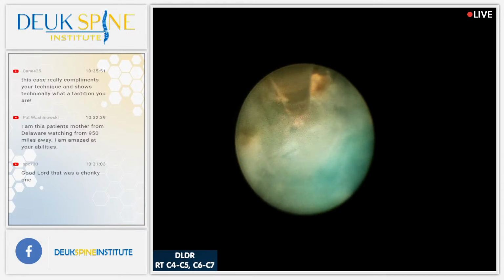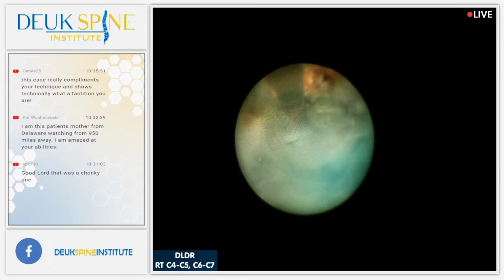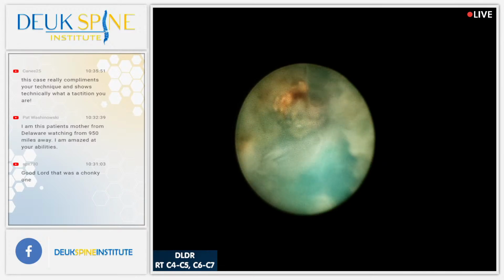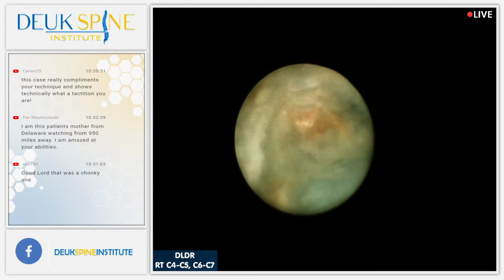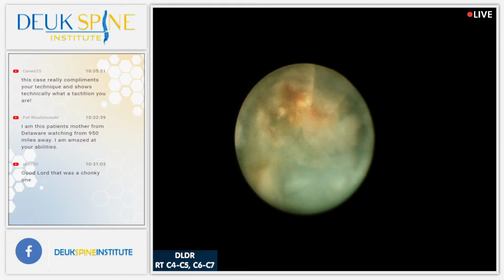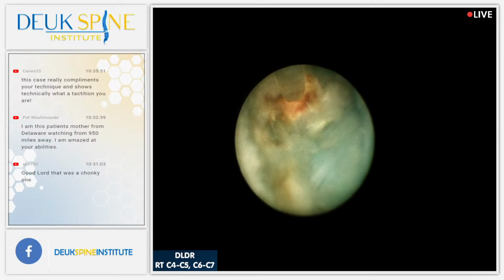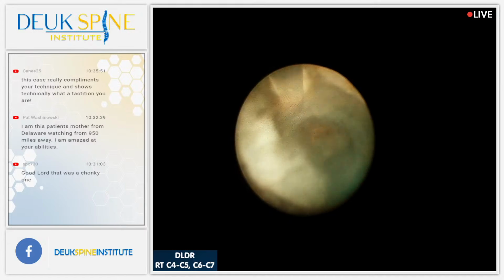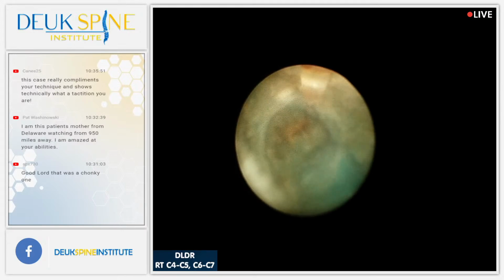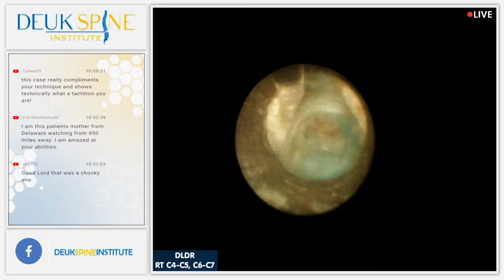Now this herniation is in the foramen. You guys can see the spinal cord. The spinal cord is right here, okay? And it wraps around and it becomes the nerve root which runs out the foramen. And all this stuff is pushing on his nerve. And so I've got to get rid of this herniation in the neural foramen. That's where we are, the neural foramen. Look at that, that wants to come out. Okay? Very delicate work. Remember, that laser fiber is half of a millimeter wide. So you know how precise this really is. I mean, it is massively precise. But look at the decompression we've already gotten.